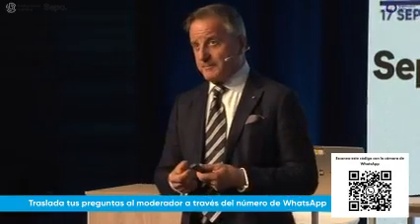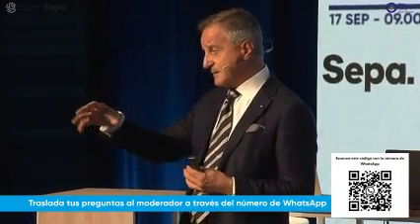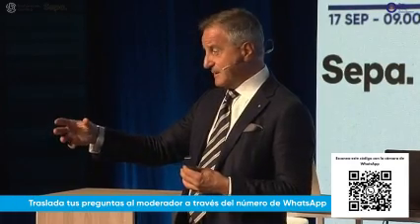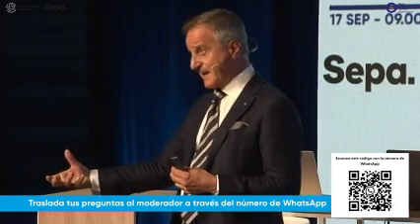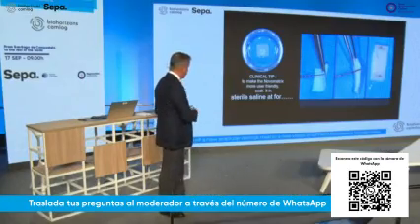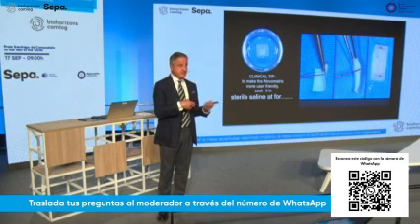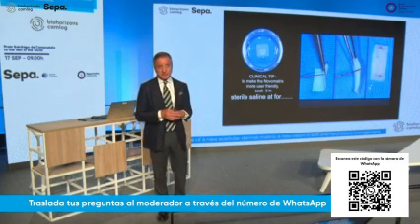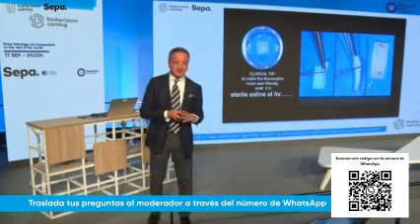We open the box at the beginning of the surgery, and in the middle of the surgery, my assistant knows that he has to change the saline in the vial. It's not evidence-based, it's just a clinical tip that we do in Milano, not, as I said, validated by the research.